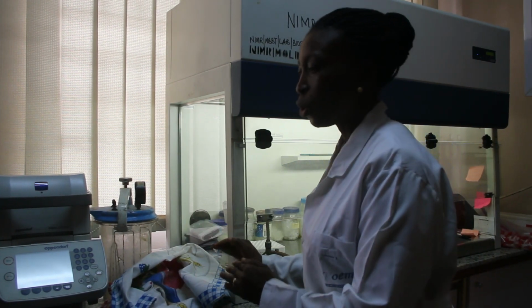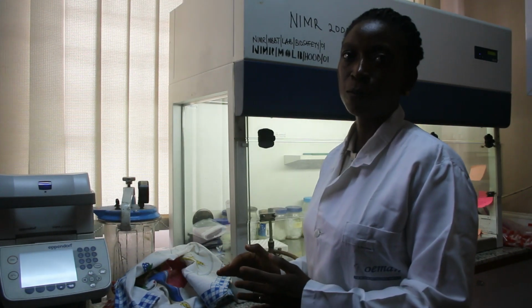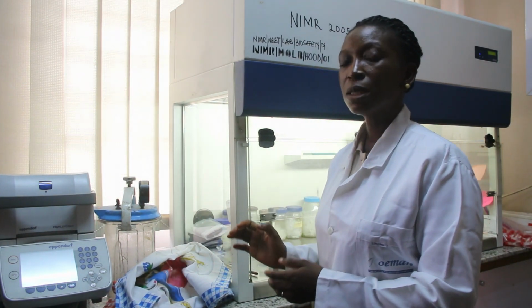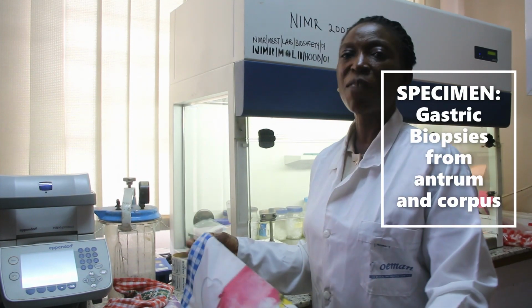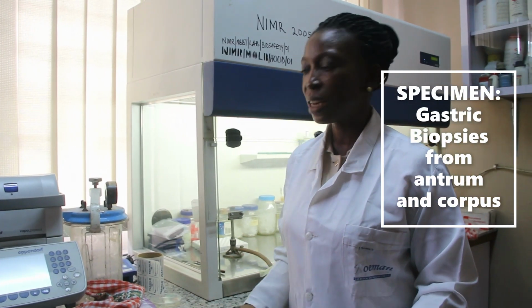But if it's ready to be used, then what are the appropriate specimens to be used for culturing? The appropriate specimen that is recommended, and from which optimal growth has been obtained, is biopsy. Although it has been reported that other extragastric samples have been used for culturing and H. pylori isolated, such as stool.